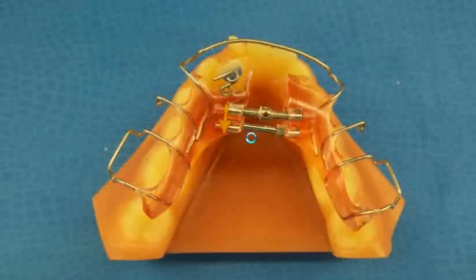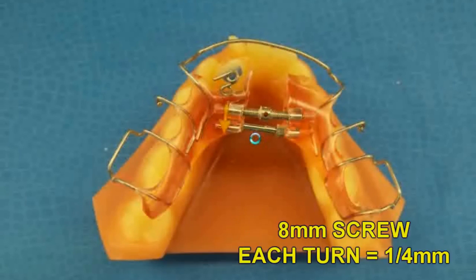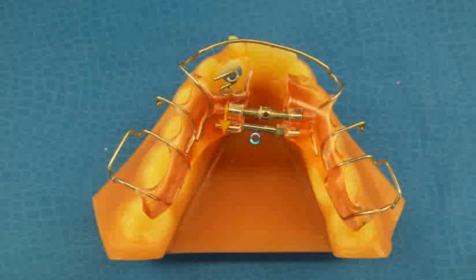This is an 8mm screw, and it will come apart if it's overactivated. Each turn is a quarter millimeter. You'll want to have the patient turn the screw one turn twice a week. It will take about 3 to 4 months to expand the arch. After the expansion is complete, you should retain the expansion for 4 to 6 months.